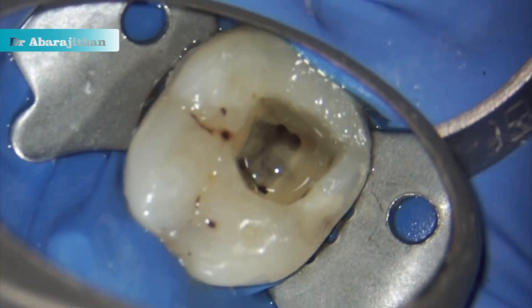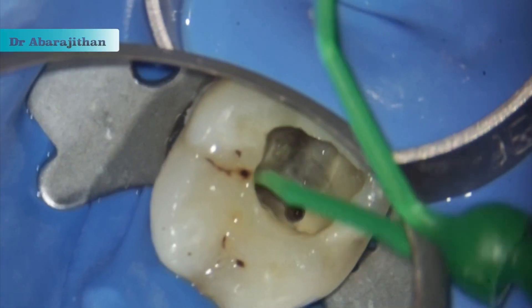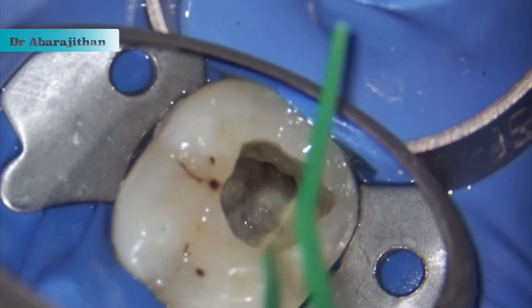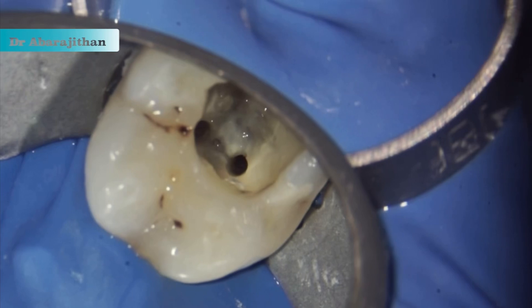Upon initial access, I could locate 4 canals — 2 in the mesial and 2 in the distal — which are cleaned and shaped completely.